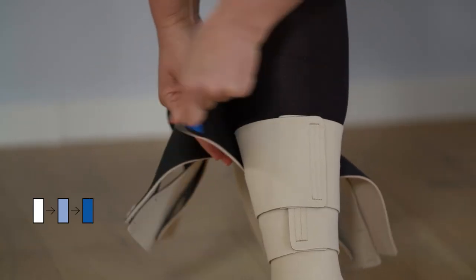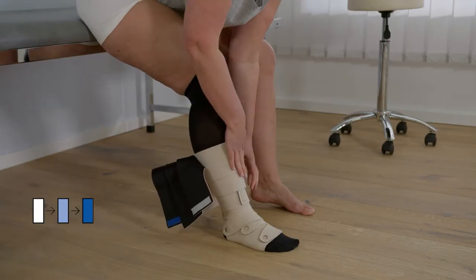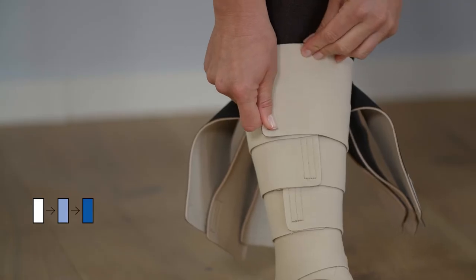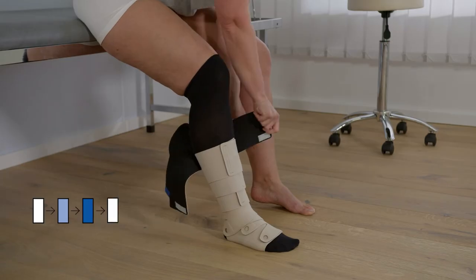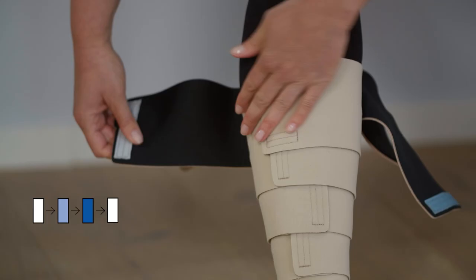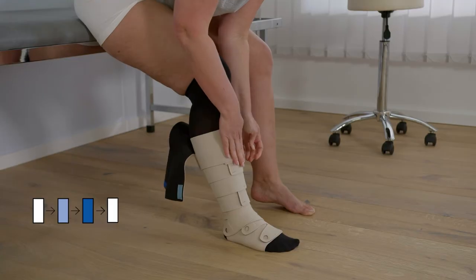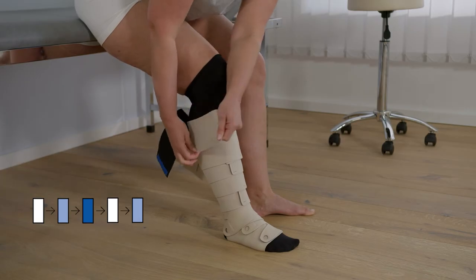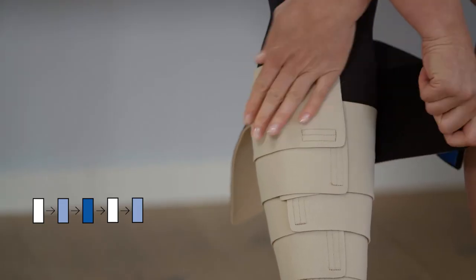In general, when securing the straps, ensure that they overlap 50% and are fully stretched. When securing the straps, always start with the straps with the white fastener, followed by the straps with the light blue fastener, and finally the straps with the dark blue fastener. Fasten the remaining straps in sequence using the same process until all straps are securely in place.